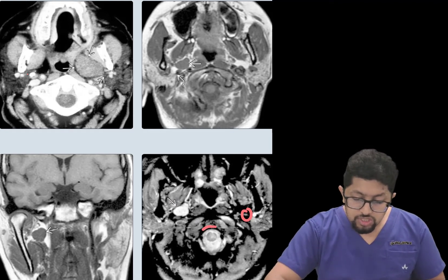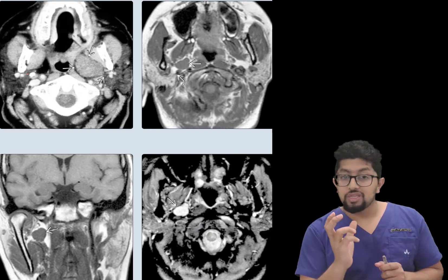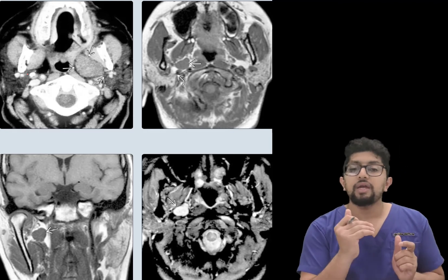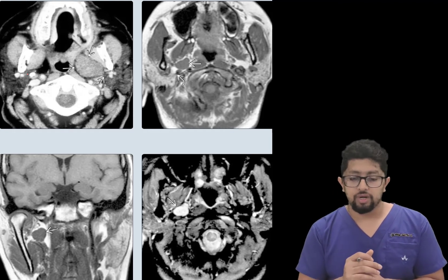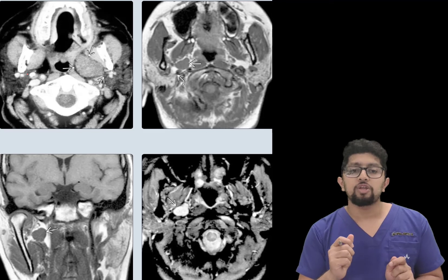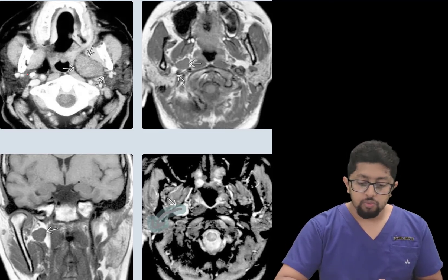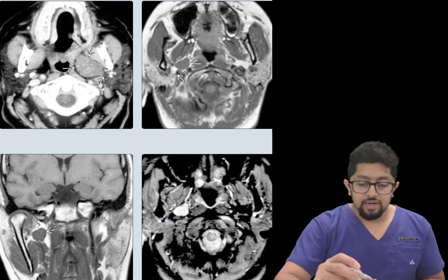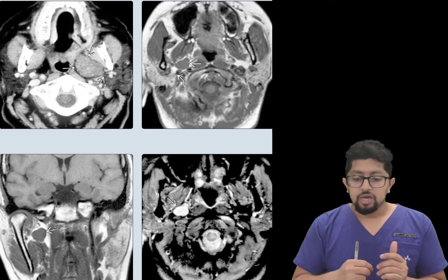On fat-saturated T2-weighted MRI, this lesion appears very bright — similar to CSF — which means it looks like a fluid. With heterogeneous enhancement, this picture is typical of a pleomorphic adenoma, also called a benign mixed tumor. This is a case of pleomorphic adenoma in the parapharyngeal space. To differentiate it from a pleomorphic adenoma of the parotid space: in parotid origin, the lesion arises from the parotid gland and there will be no fat cleft separating the lesion from the parotid gland, whereas that fat cleft is clearly visible here on both CT and MRI.